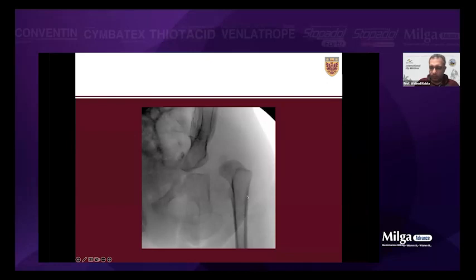I get a 4-hole small fragment plate, or a 5-hole. I put in 2 screws at the top, and I drill before cutting. After I drill them, I remove 1 screw and loosen the second one. I flip that plate at the top, and then we do the first cut. Then they get the overlap. We do the reduction, and the amount of overlap with the reduction is the amount I need to cut. So it's usually a centimeter, maximum 2 centimeters in older kids.